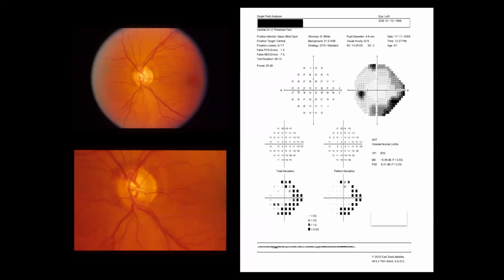We can compare the visual field of the patient to the examination to see about the, for example, we see it here in the temporal side, so we'll expect the defect to be in the nasal side on the optic disc. Good. Excellent.